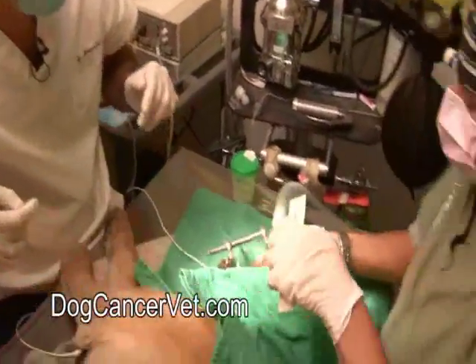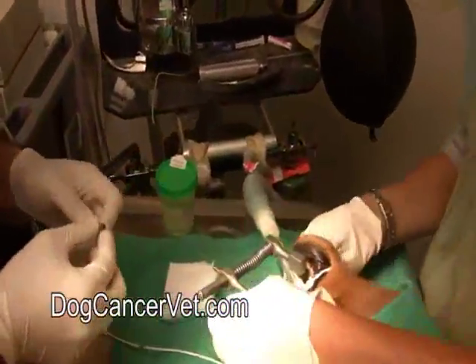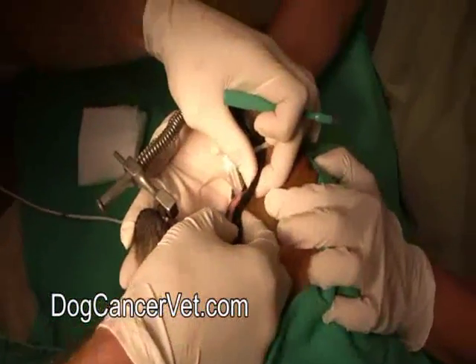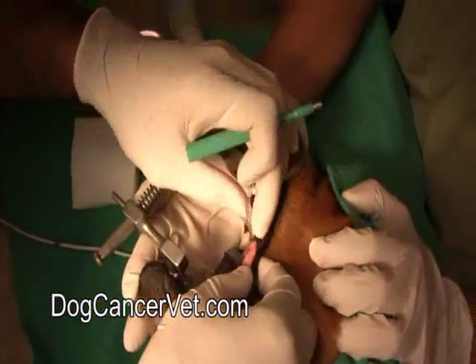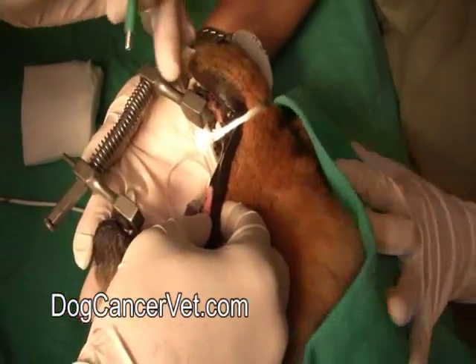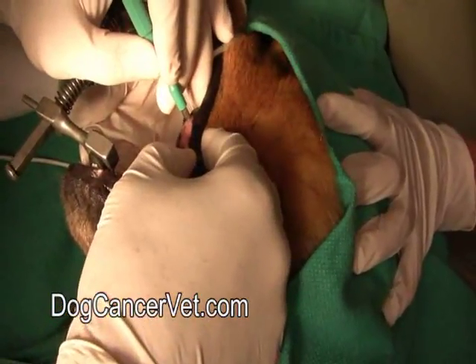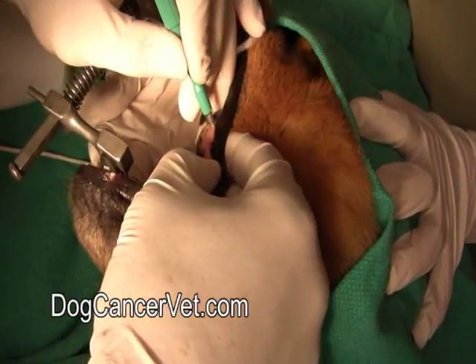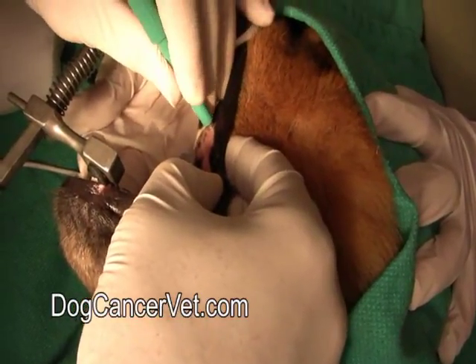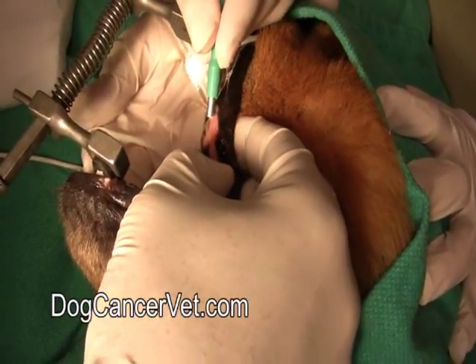So Karen, why don't you go ahead and get my biopsy punch for me? All right, we're going to take a little bit of gauze over here, and she's going to help a little bit by positioning. I need to pick an area that looks like there's going to be some action, because I don't want to get a false negative on my biopsy. False negative means that the pathologist says, oh, we don't see any cancer, when actually there is cancer. What it means is you missed the spot. So we're going to go right there, right on the edge, and we're going to just twirl a little bit to make sure that we have some cutting. And we're going to see if it pops out.